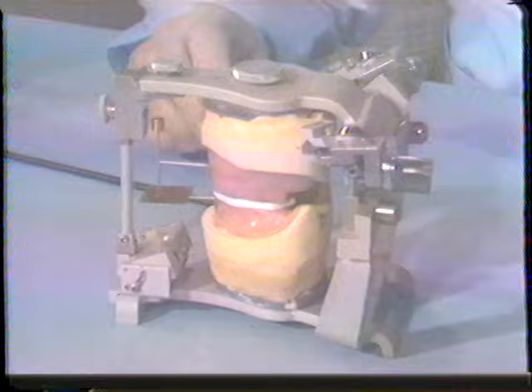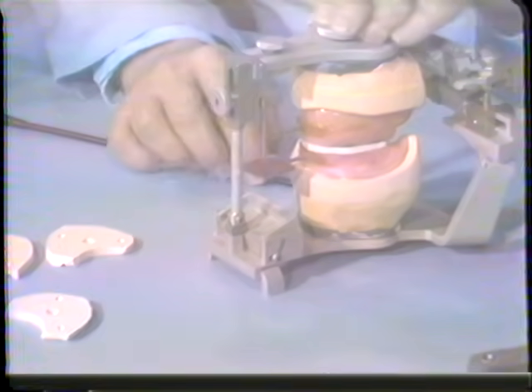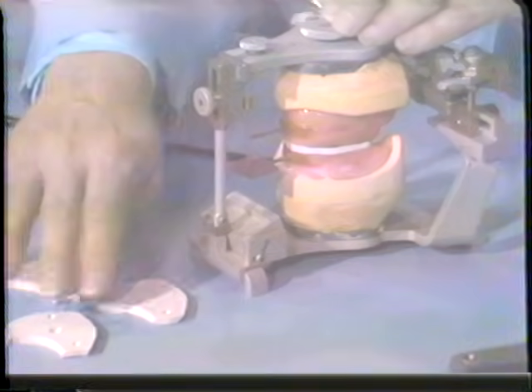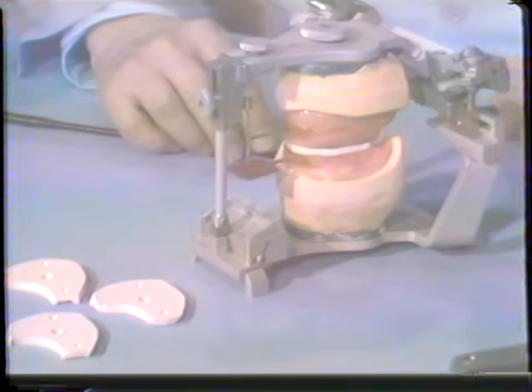Now essentially, we're using three records at this time with this instrument that we have come to know at the school, the Dentatus instrument. Now you can use this instrument only with a protrusive record, or you can make your additional lateral records. Particularly for complete dentures, you can go either way.